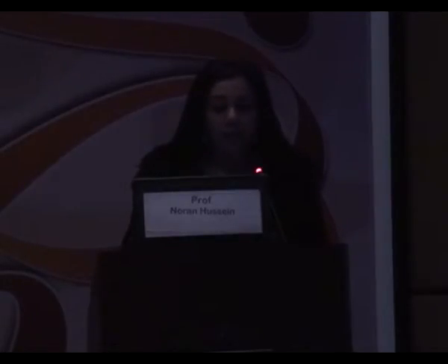So patient handling, first of all, contrast administration, and I've just heard the discussions about contrast. I agree with Dr. Khaled that there are some lesions that you can see, especially when it's a fatty breast, but the guidelines are that you have to use contrast in MR examination until now. The dose of contrast varies in different studies between 0.05 to 0.2 millimoles per kilogram, but what is mostly used is the 0.1 millimoles per kilogram, and of course it's important to do it within the proper menstrual cycle phase, which is day 5 to 12.